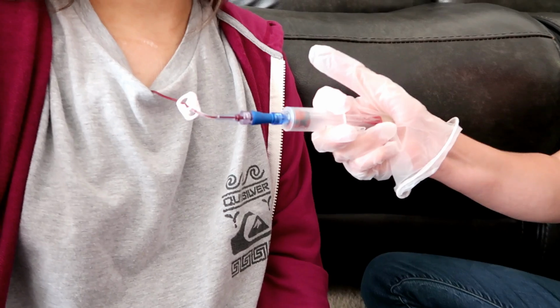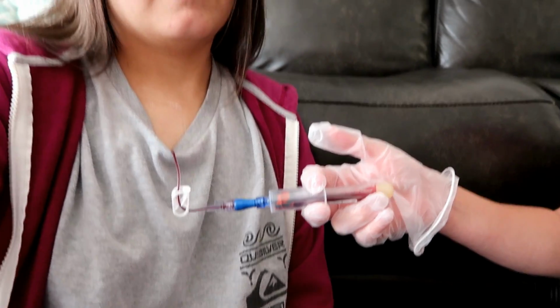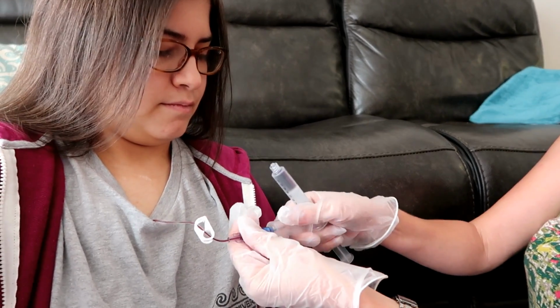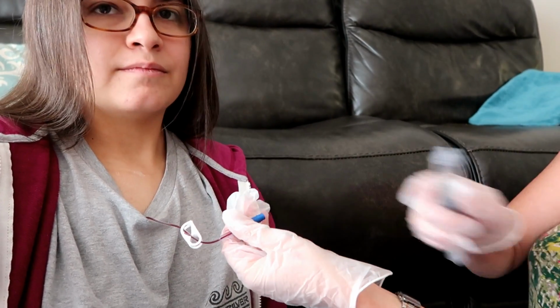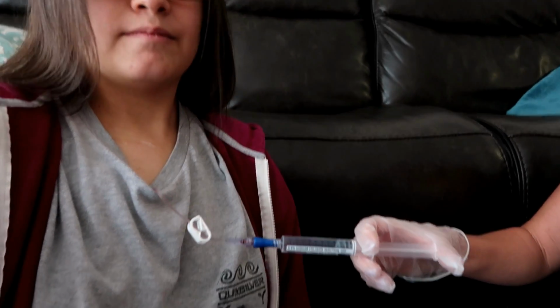This thing is going, so I'm really happy about this. I know, thank God. All right, last one. And then after this, we're gonna take the vacutainer off and then push 10 cc's of normal saline. And I gotta push my pre-meds and we'll just do IVIG. Here we go. See, now we're clearing out that line. That went perfectly. So that was a lot of blood. Do you feel okay? I feel great.